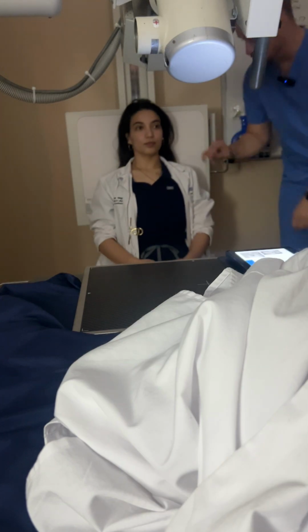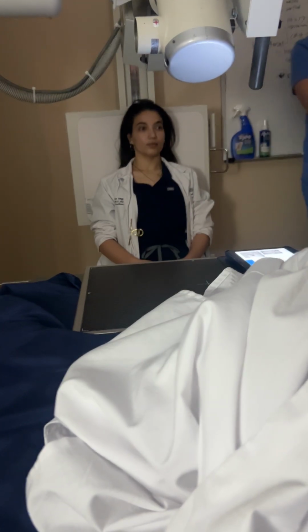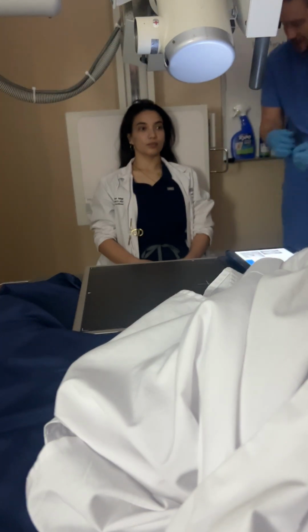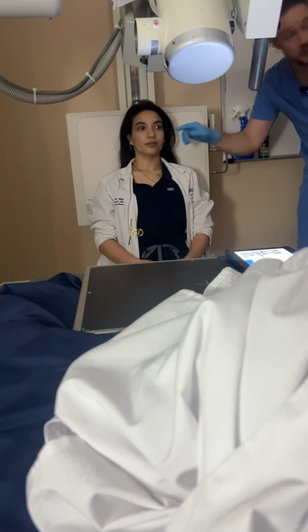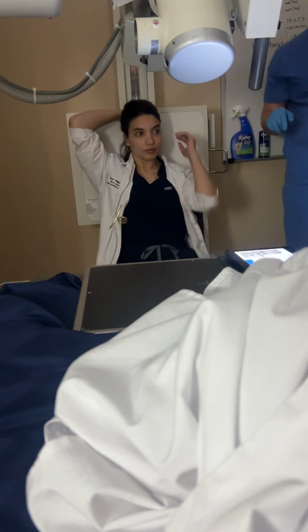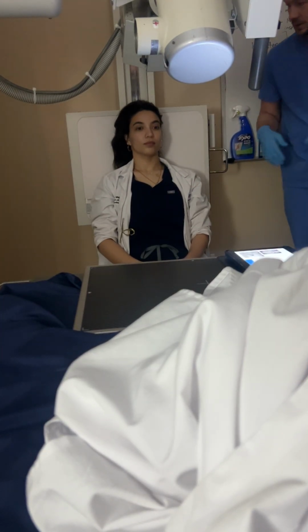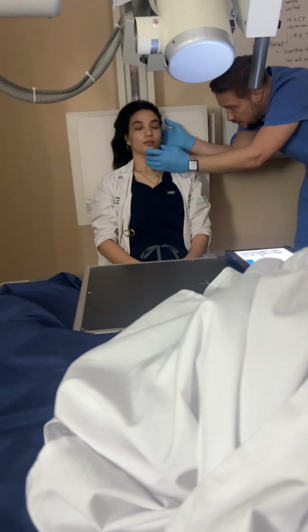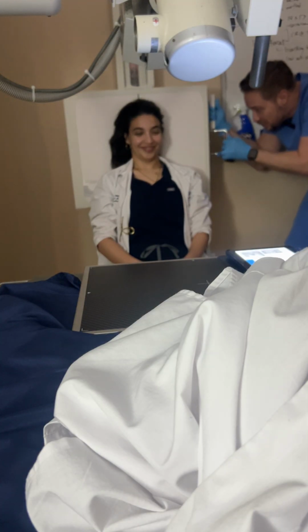Okay? So for Nora, sorry, let me get a glove. For the test, which one do you want? I don't care as long as it's right. IOML. There's a 7-degree difference between the orbitomeatal line and the infraorbitomeatal line. The infraorbitomeatal line is here to her ear hole. And OML is outer canthus of the eye, where the eyelids meet, to the EAM, or external acoustic meatus. It's literally the ear hole. So we're going to use her OML. We're going to tuck her chin way down. Is that comfortable, Nora?